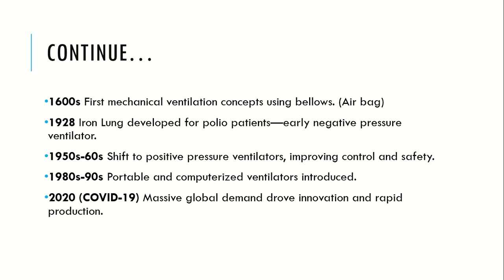In the 50s and 60s, we shifted to positive pressure ventilators, which improved control and safety for patients. In the 80s and 90s, portable and computerized ventilators were introduced, which made their use easy. The COVID-19 pandemic in 2020 increased the demand for ventilators.